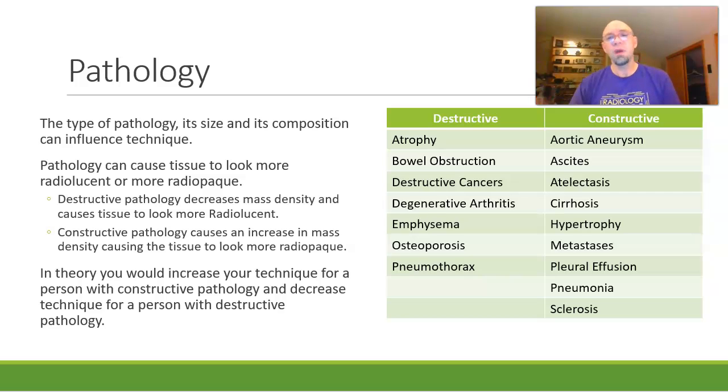Now, you should be aware of the different destructive pathologies that there are, as well as constructive. You should also know that destructive could be considered subtractive, and constructive might also be called additive. So look for those two different names. It doesn't have to be destructive and constructive. It could be additive and subtractive. So just think of it this way.